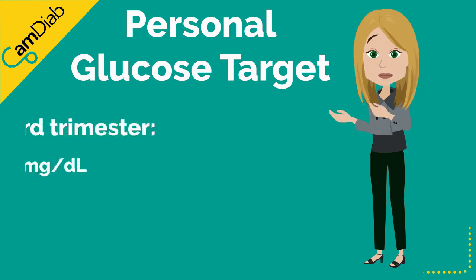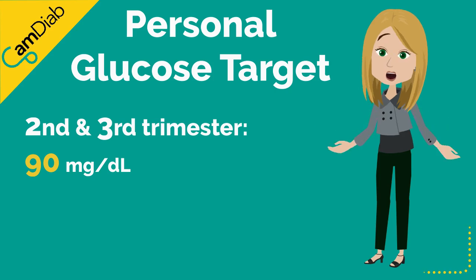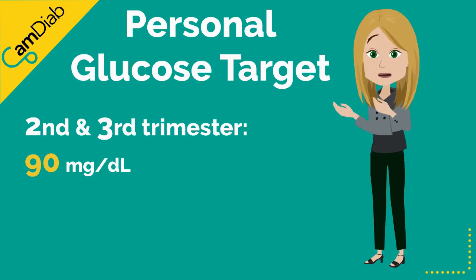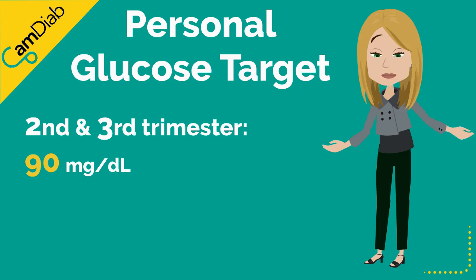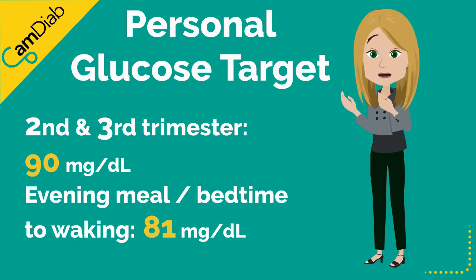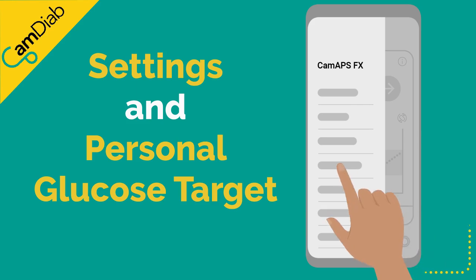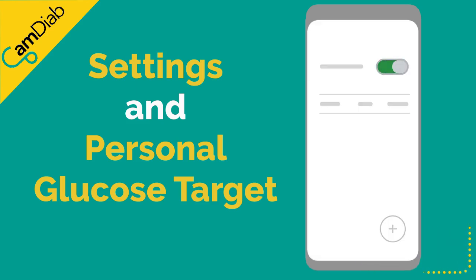In the second and third trimester, the personal glucose target is often lowered to 90 milligrams per deciliter in the daytime. If appropriate, the overnight target might be adjusted from the evening meal or bedtime to waking to 81 milligrams per deciliter. You can change your target in the settings and personal glucose target menu in the app.